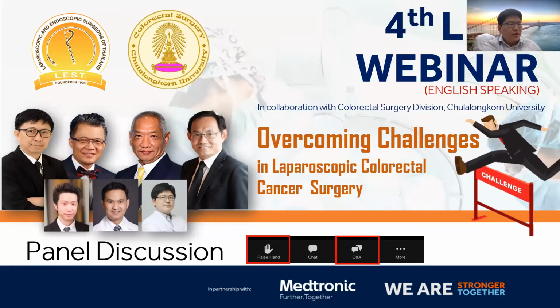The first one is the port placement when I do the splenic flexure takedown. When I want to do the splenic flexure mobilization, I tend to use the left upper quadrant port for the right hand. But if it's not enough, I will add one more port at the right upper quadrant and use it for the left hand.